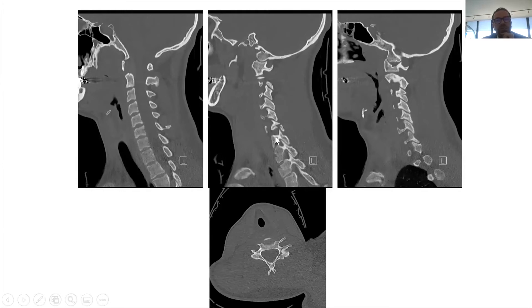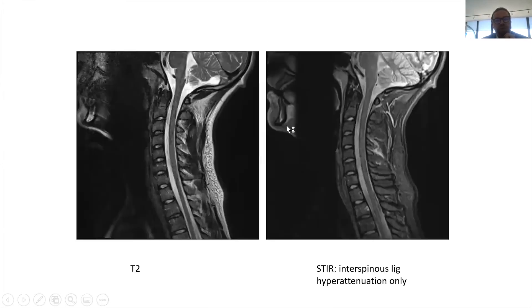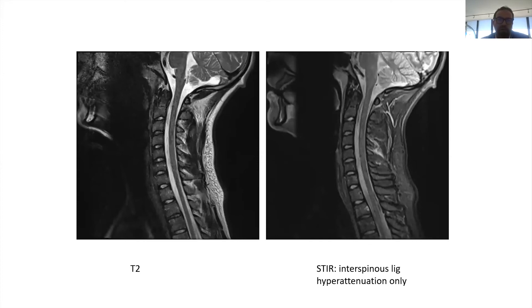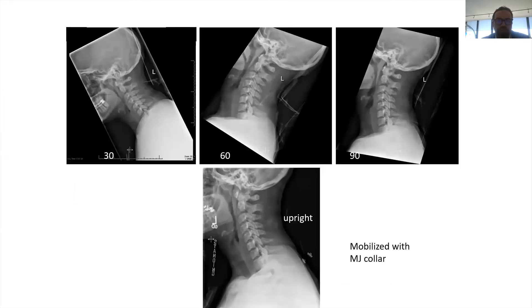Here you can see the unilateral non-displaced facet fracture on MRI. There's a little STIR signal but it's not totally disrupted, so you give it a one rather than a two. We calculate what's called the Sub-Axial Injury Classification (SLIC) score — and in this case it's less than four, so you can treat this patient with a neck collar.